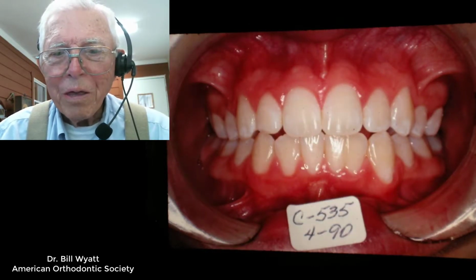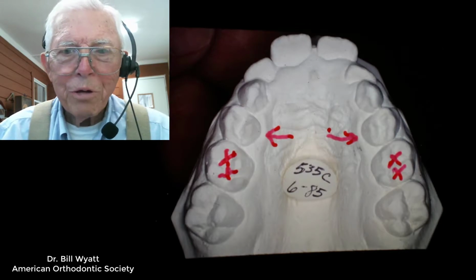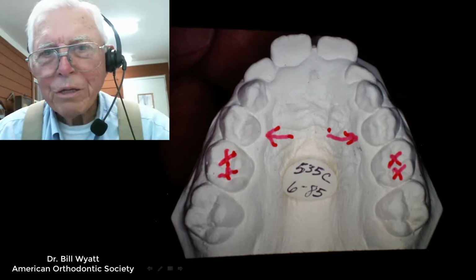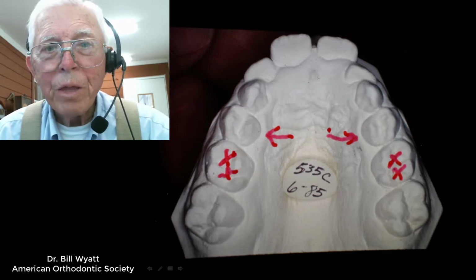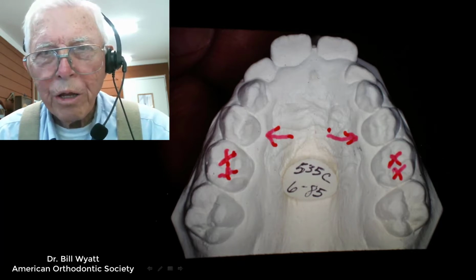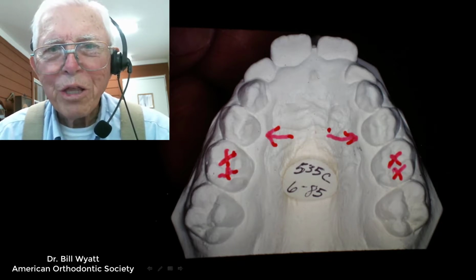All right, then here is the other side of the mouth, and there it is in a class 1 relation. And I'll guarantee you that if you go in and change somebody's facial structure that makes that much difference, that person will achieve more in his lifetime than you would if you left him looking terrible. Now, that's something for orthodontics. We did that with a few wires and some bonding material and extracted a few teeth in there.